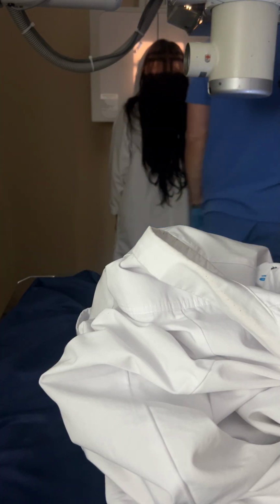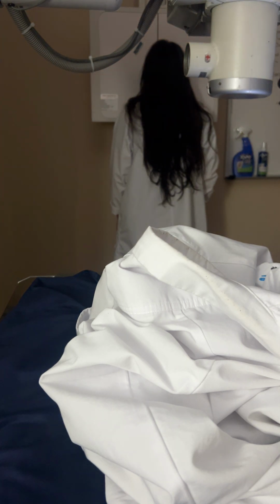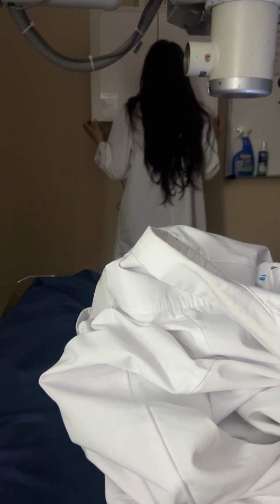The important consideration for your evaluation criteria for a Waters method is that the petrous ridges are projected below the level of the maxillary sinus, okay? So these guys right here are your petrous ridges. They're thick and they're hard. When we do that correct positioning for the Waters method, we project these petrous ridges below the level of the maxillary sinuses. The Waters method is to look at all the facial bones without really any superimposition, and we get the petrous ridges below the maxillary sinuses so that we can evaluate the maxillary sinuses as well. Okay?